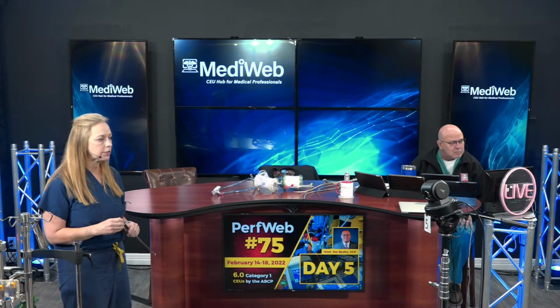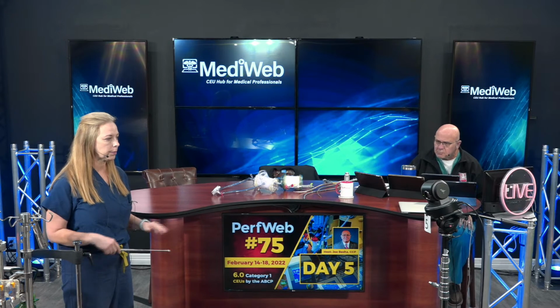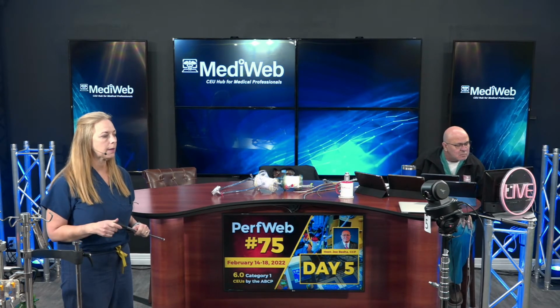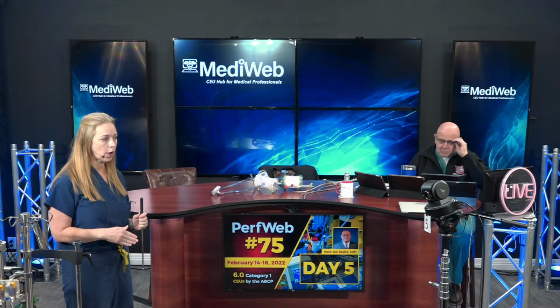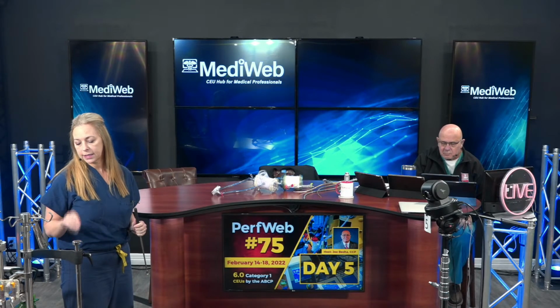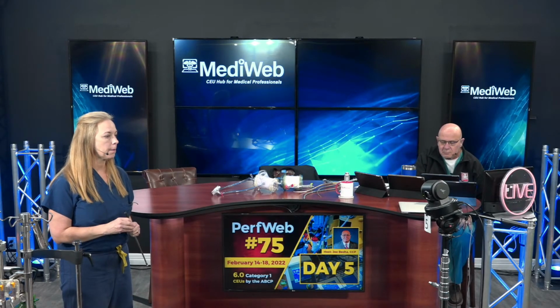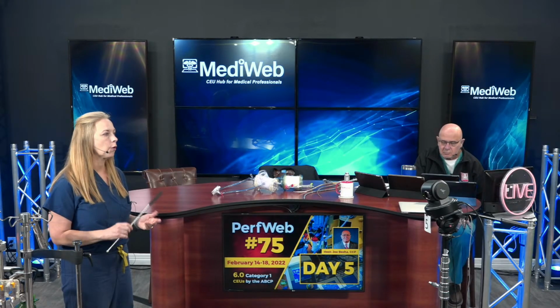If you have a patient who's been diuresed, that's going to take place over a certain period of time. And so sometimes you are able to catch that you are getting behind on volume before it becomes such a critical state where your flow is being stopped and started again. So that's something to watch for in your rounds.